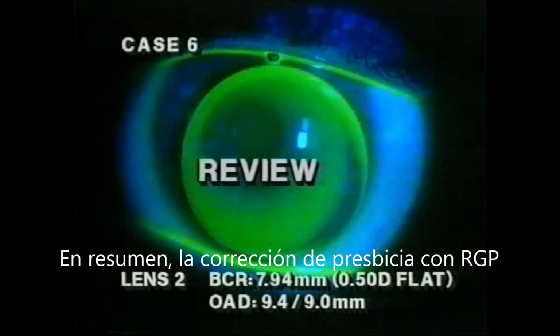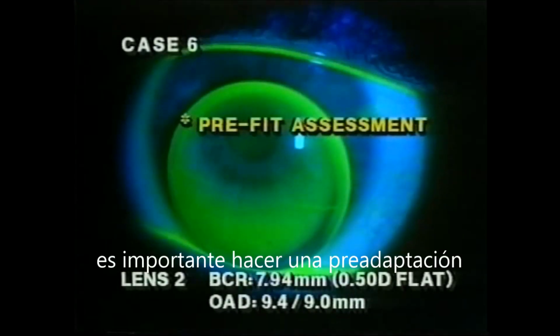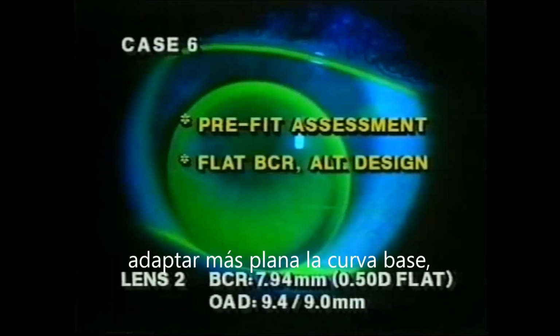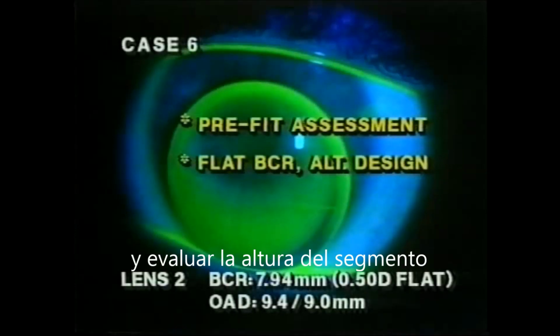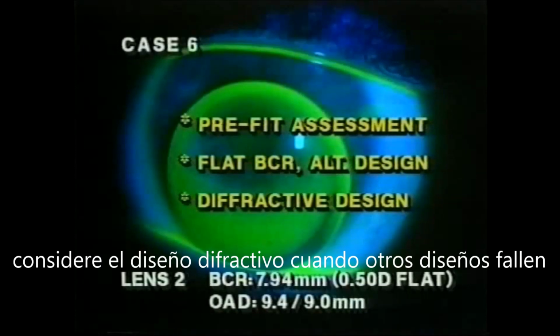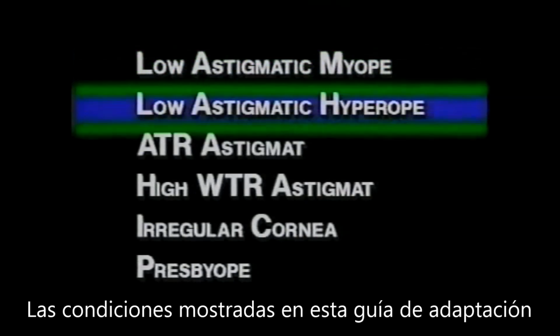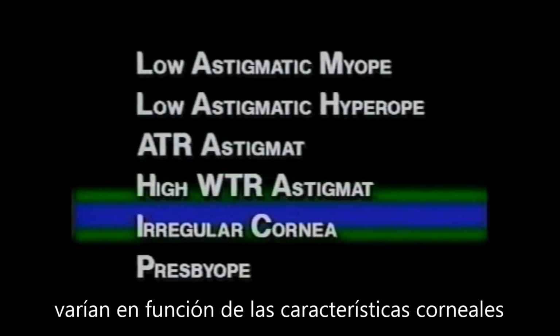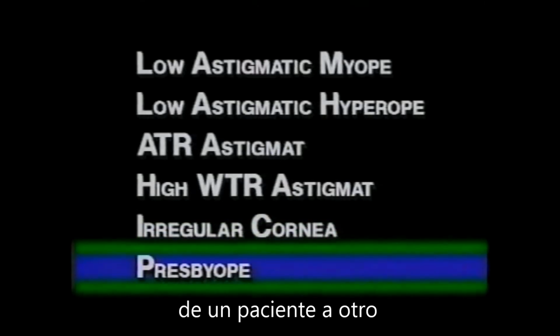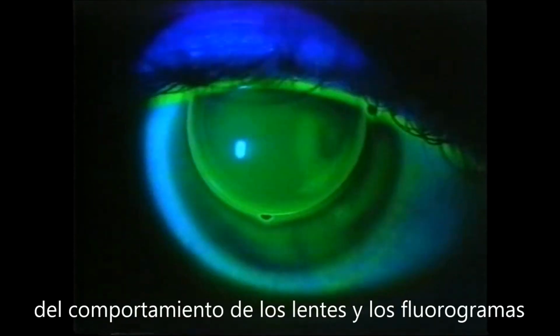In summary, when fitting a presbyopic patient with rigid lenses, it's important to perform a comprehensive pre-fitting assessment. Select a slightly flat base curve radius when fitting a prism ballasted truncated design. Consider a diffractive design when use of an alternating lens is not feasible. These 6 routine and difficult to fit cases highlight the individual variation in corneal topography seen from patient to patient. From these examples, it is hoped that the importance of diagnostic fitting and fluorescein pattern evaluation is understood.